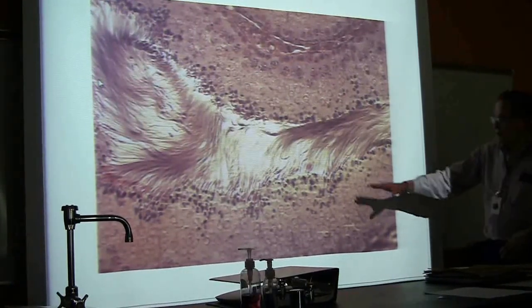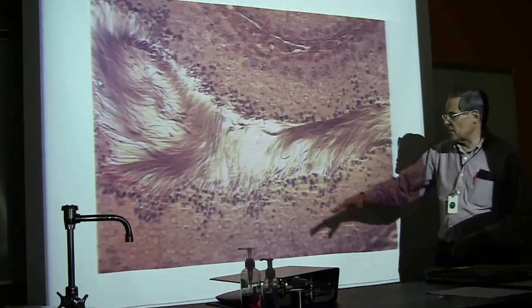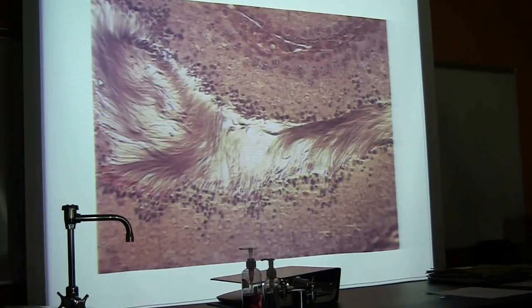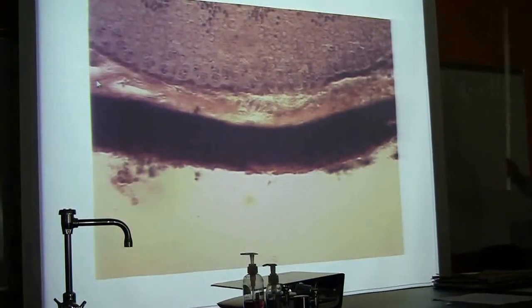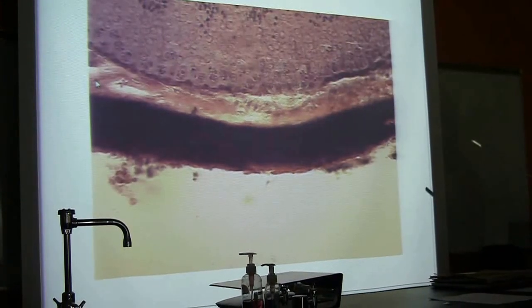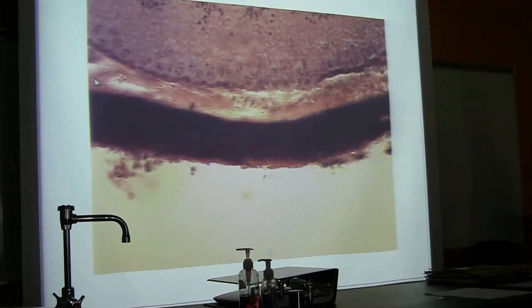They're produced by these spermatogenic cells that release them into the lumen of the seminiferous tubules of the testes. And again, you can see here's part of the capsule, the tunica albuginea, that surrounds the organ. Any questions on the testes?